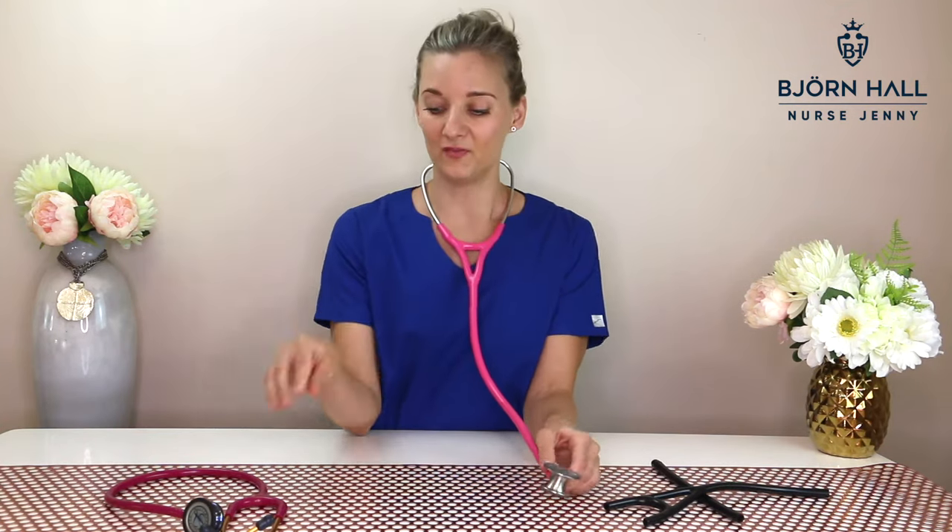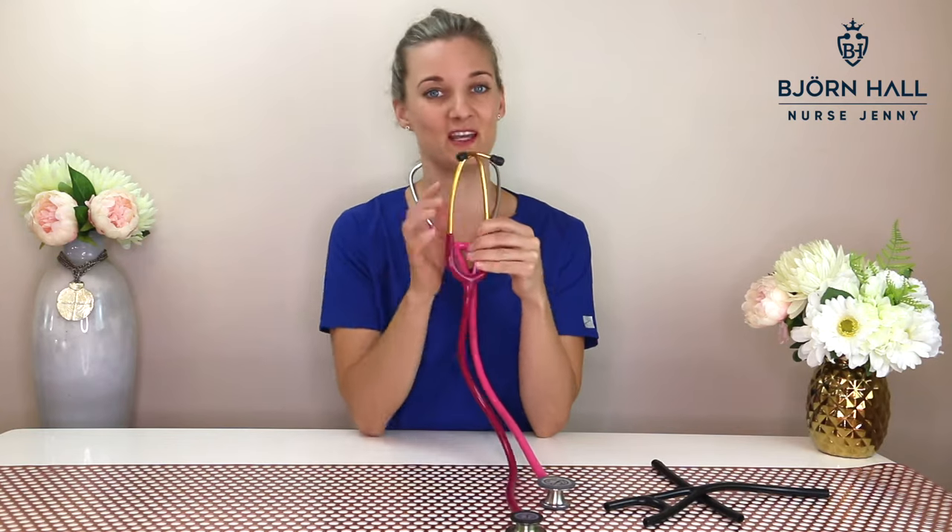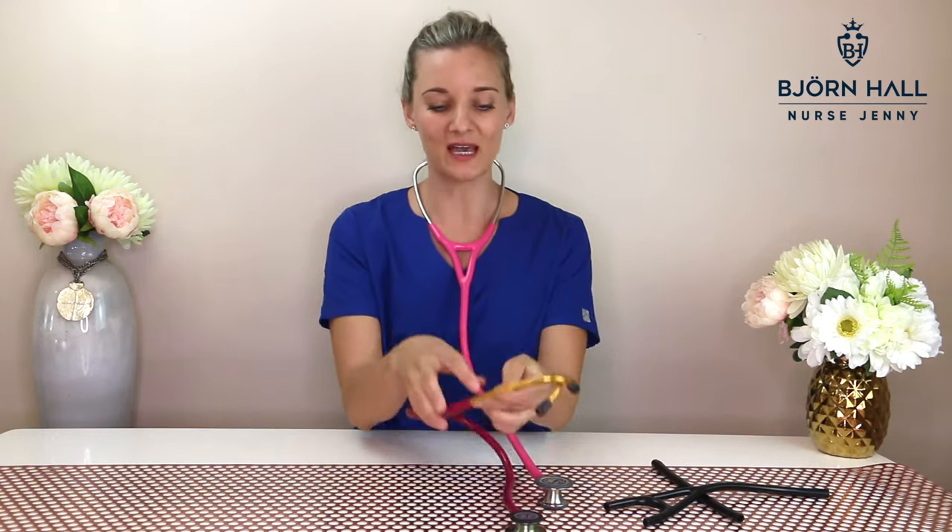What this does is it allows for less interference with rubbing noises. For example, if I'm using the stethoscope and I'm brushing against sheets on this side, it's not going to interfere with what I'm hearing on my left. But if you're doing that with the Classic 3 and you're brushing on this side, you're going to hear it all around in both ears. So that's what dual lumen tubing means.